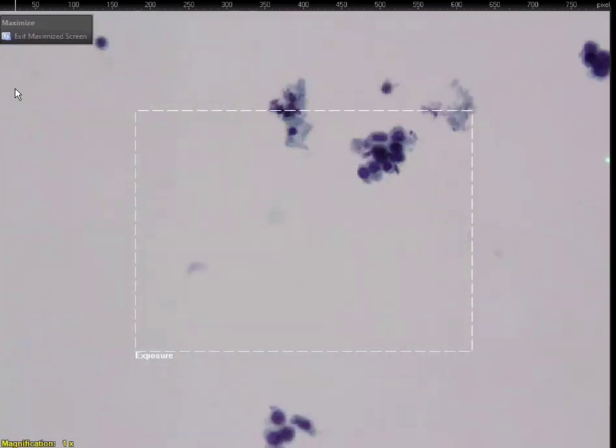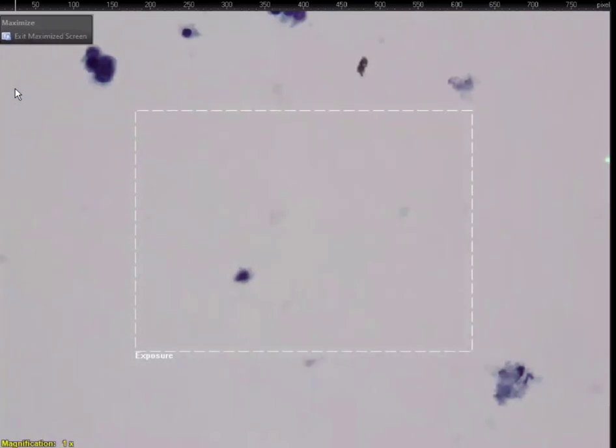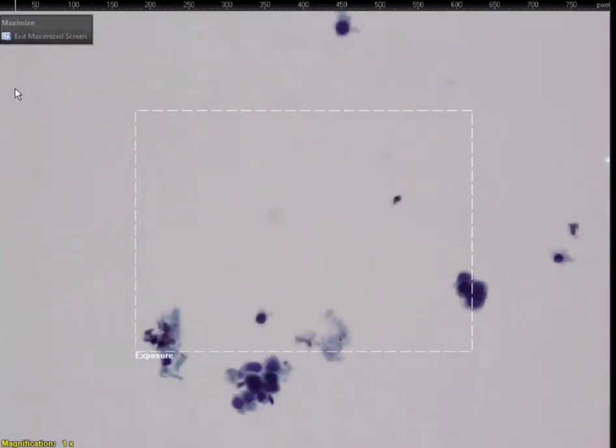During a bronchoscopy procedure. Okay. See, some of these look epithelial. More epithelial. It's good to know the path the needle took, because sometimes now, if we're looking for groups, this is going to really throw us off, right?